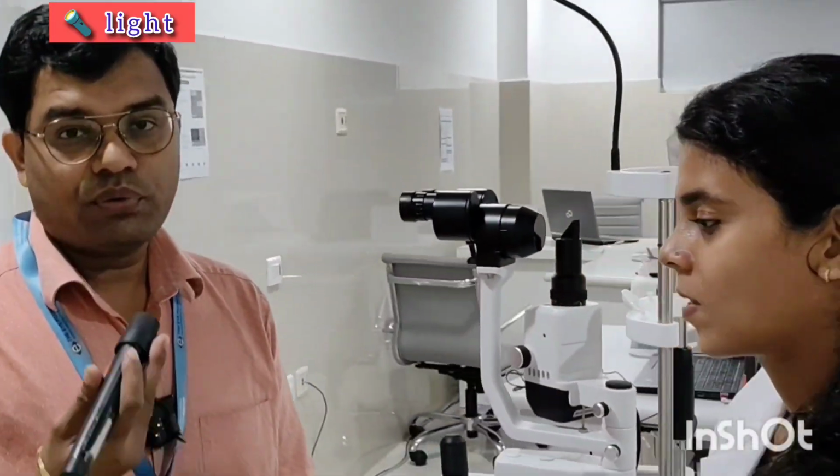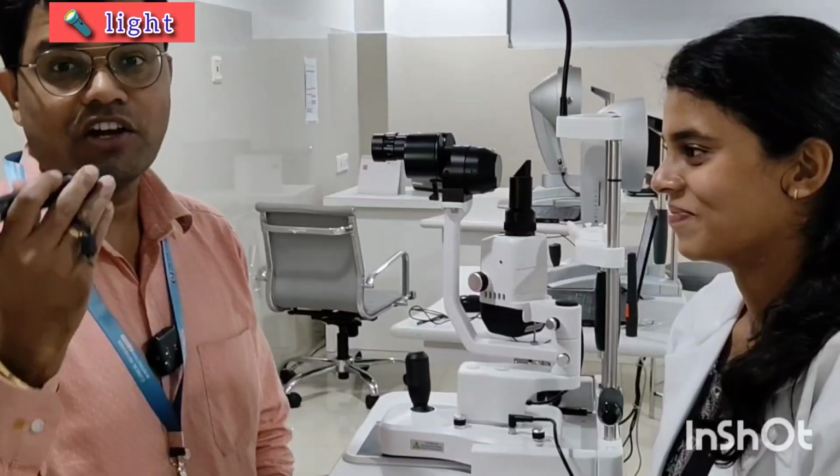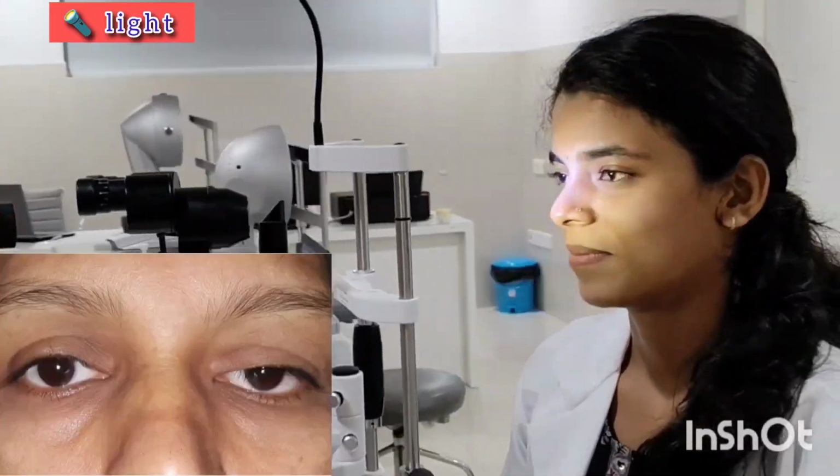Before doing slit lamp examination, we need to do torchlight examination to identify basic facial abnormalities, eyebrow anomalies, and orbital anomalies.